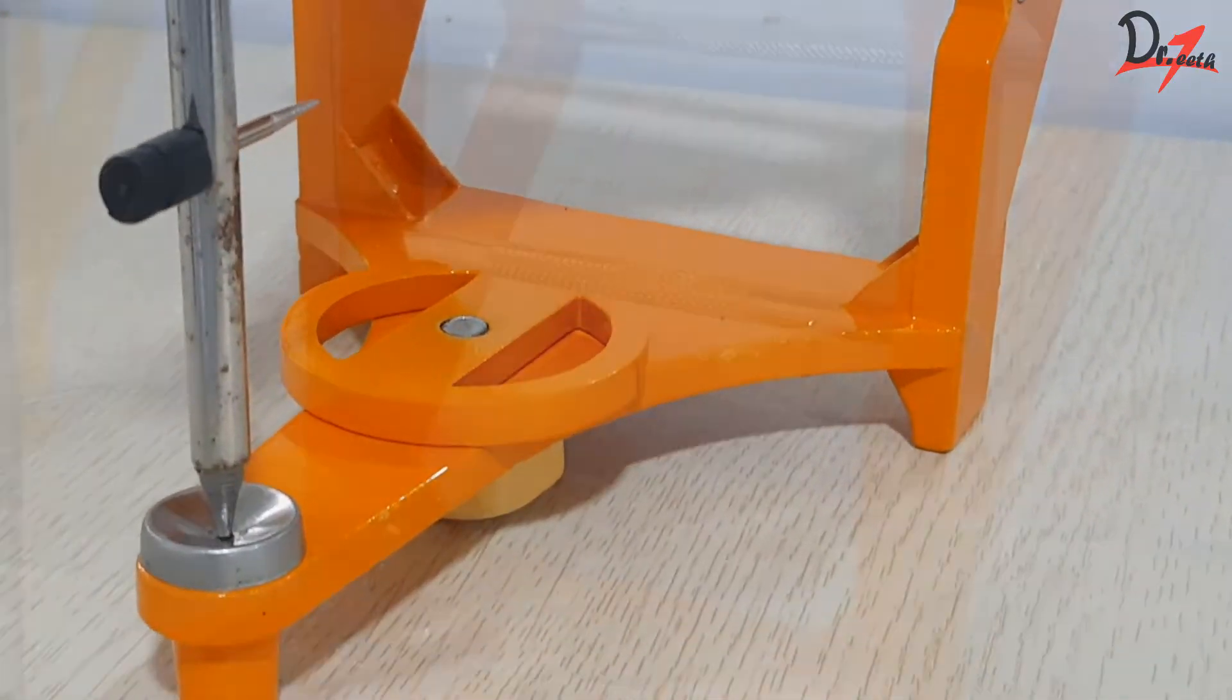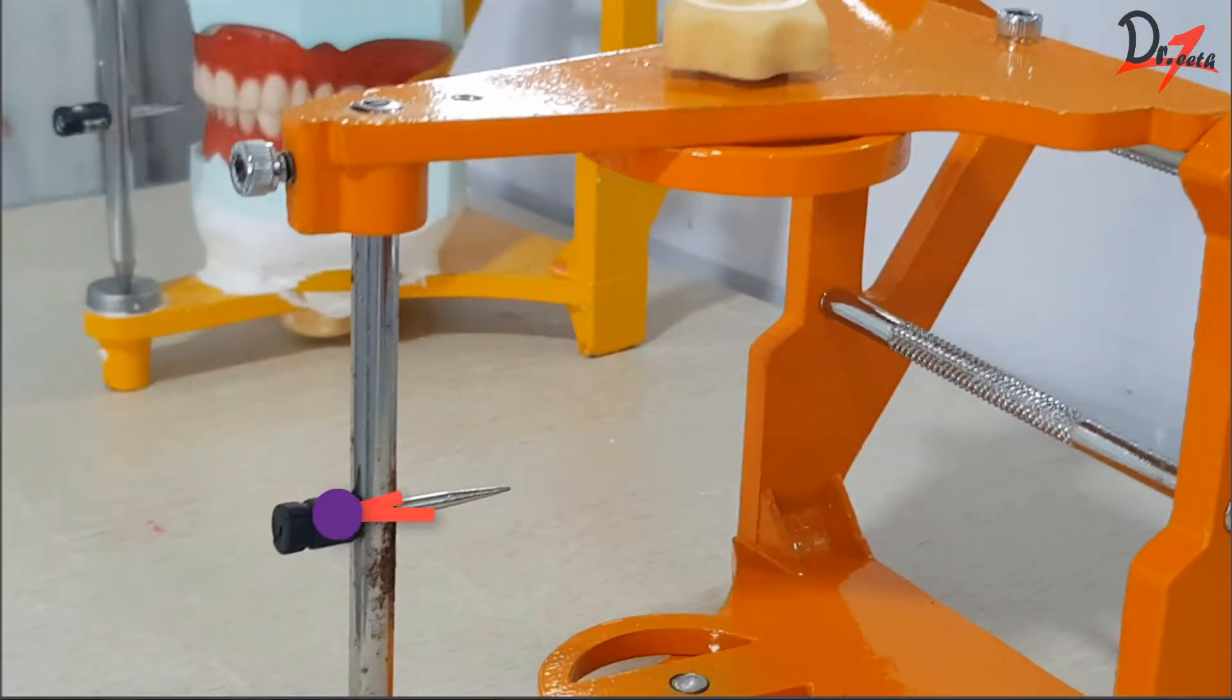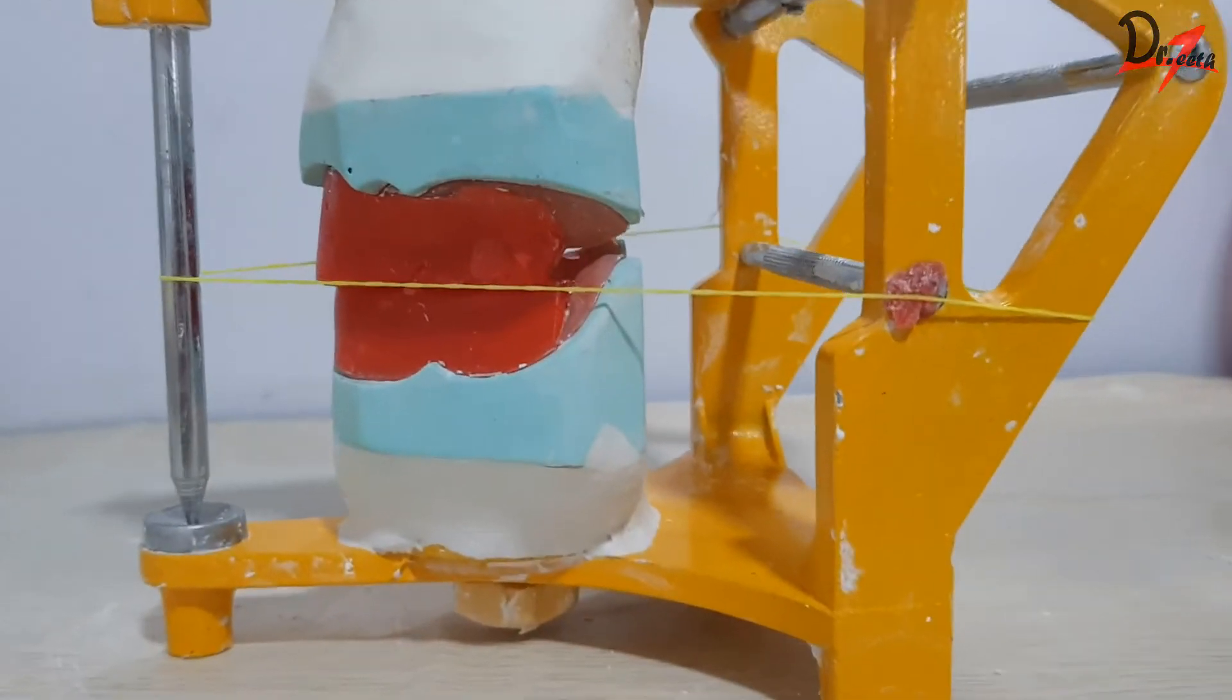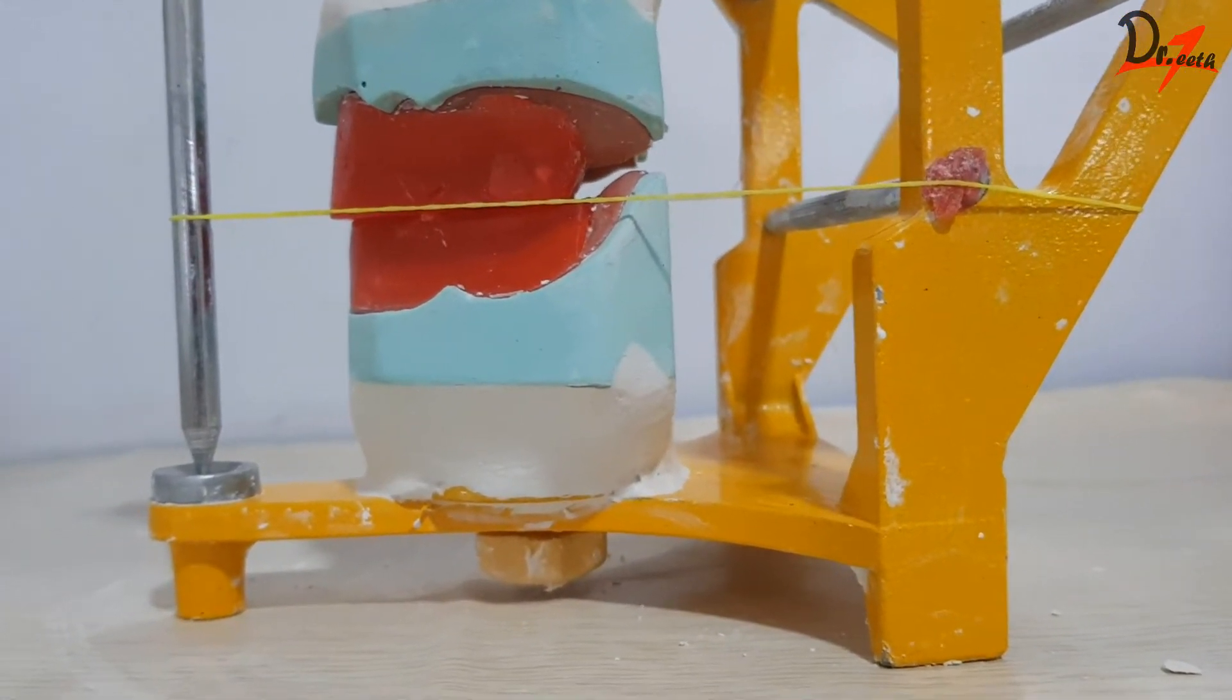Now, in the mean value articulator, a plane is formed by the central pin anteriorly and the reference rod posteriorly, as you can see here. So, while mounting, we have to make sure that the plane of the occlusal rim should coincide with the plane formed by the articulator.